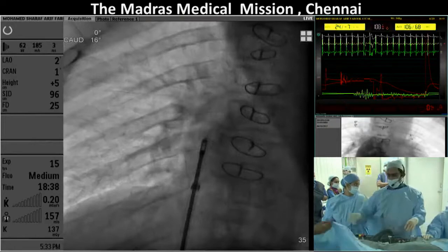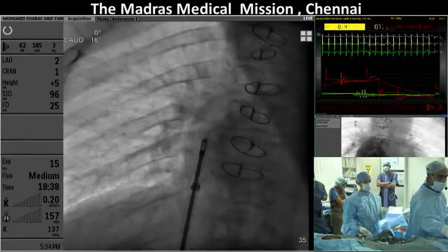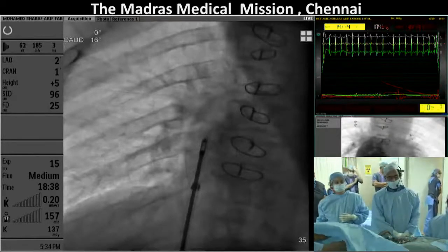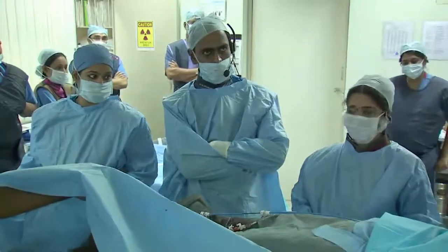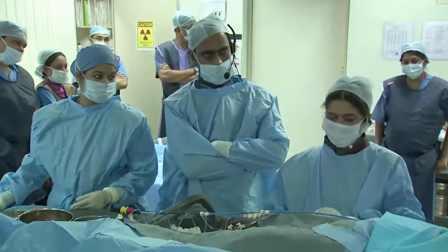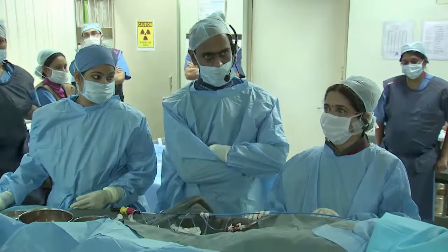You have a question over here in the right front. Hi, this is Dr. Ashish from India, J J Nagar. Hi, sir. Thank you for a brilliant case here. I have two questions for you. First, your experience regarding this atrial flow regulator and changing the aperture diameter previously. And second, in a condition like this, where after closing you get the PA pressure around 13 or 15, your opinion regarding complete occlusion of this fenestration.